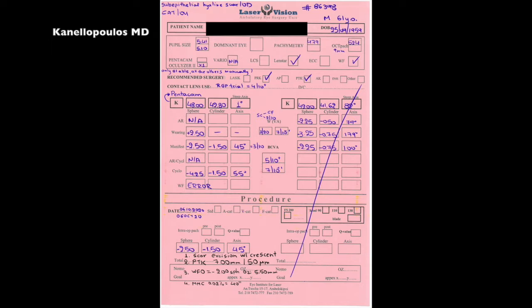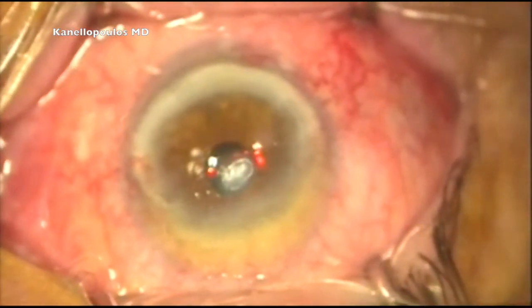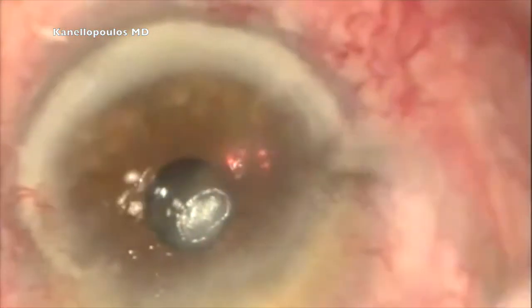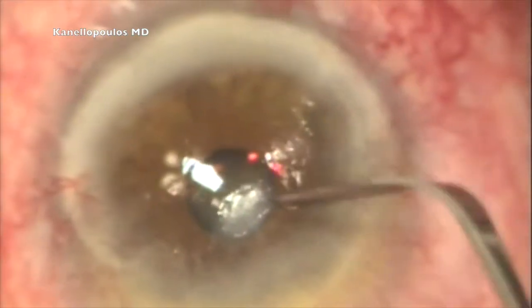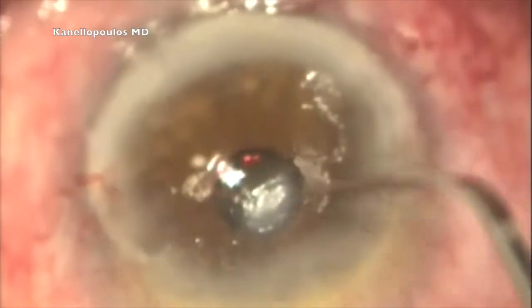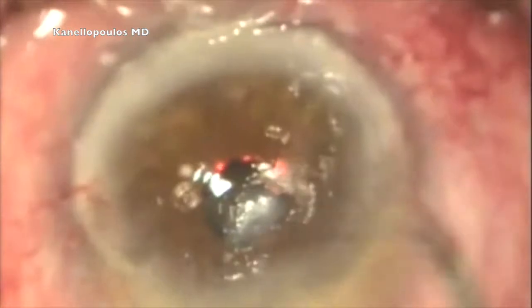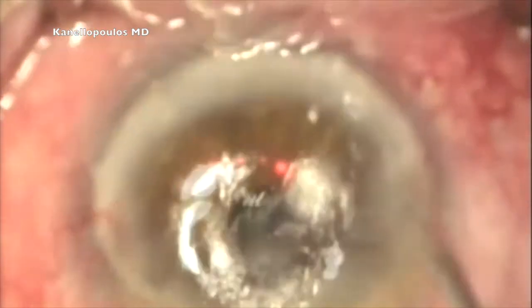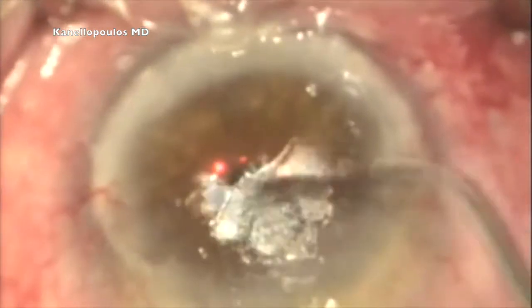What we're going to do as a first step is go in and surgically remove the Salzmann nodules. You can see that there's significant scarring in the inferior part of the cornea, so there's some severe external disease going on, which we will treat with topical cyclosporine A, autologous serum, and topical steroids. But in order to visually rehabilitate this patient, I'm going in with a crescent blade and I'm going to scrape off this irregular elevation — you can see that it easily comes off.